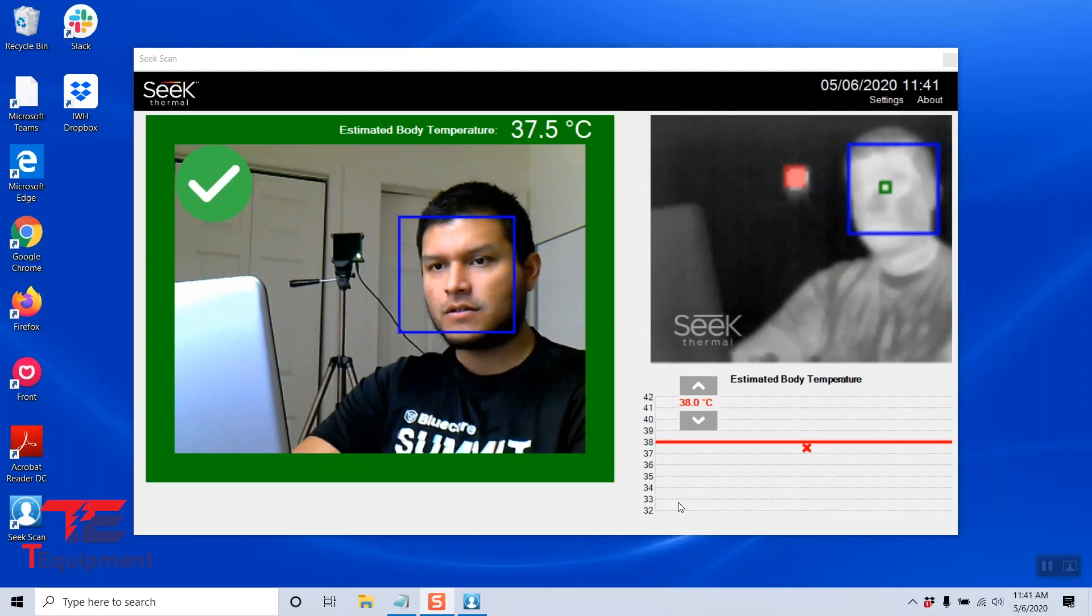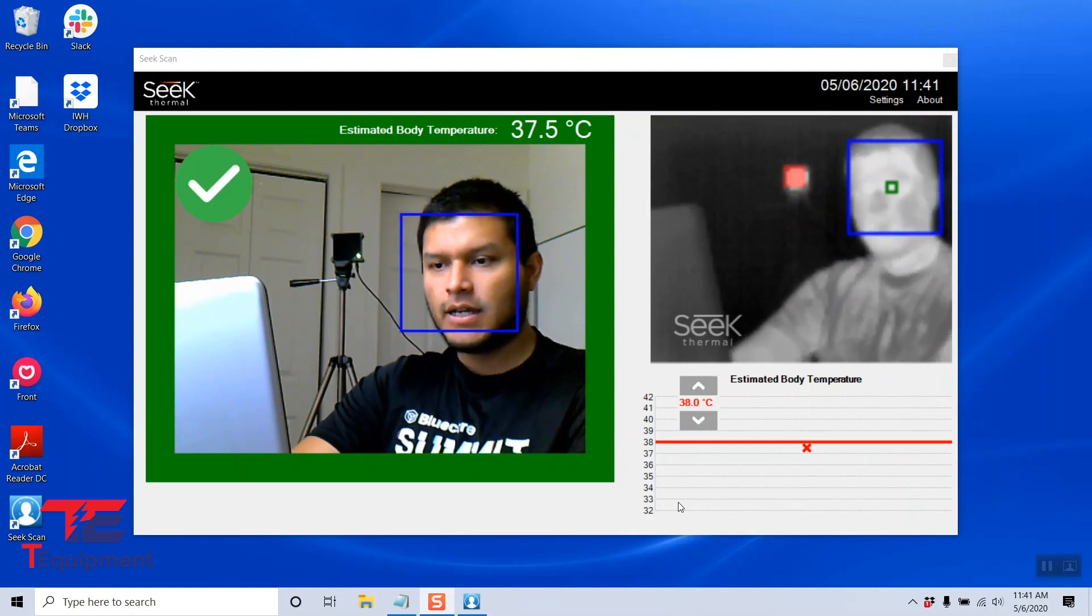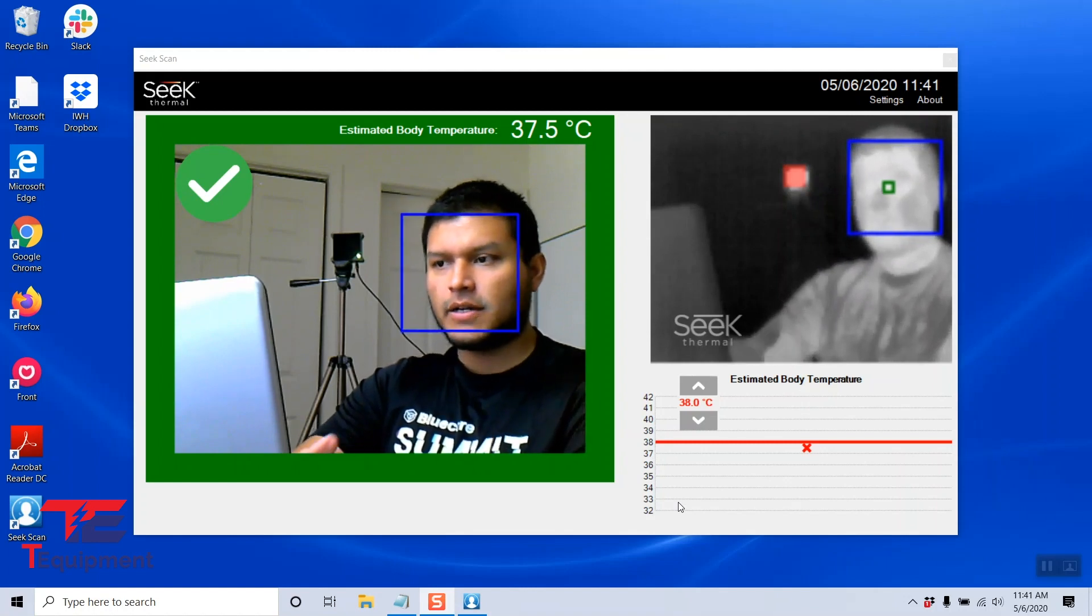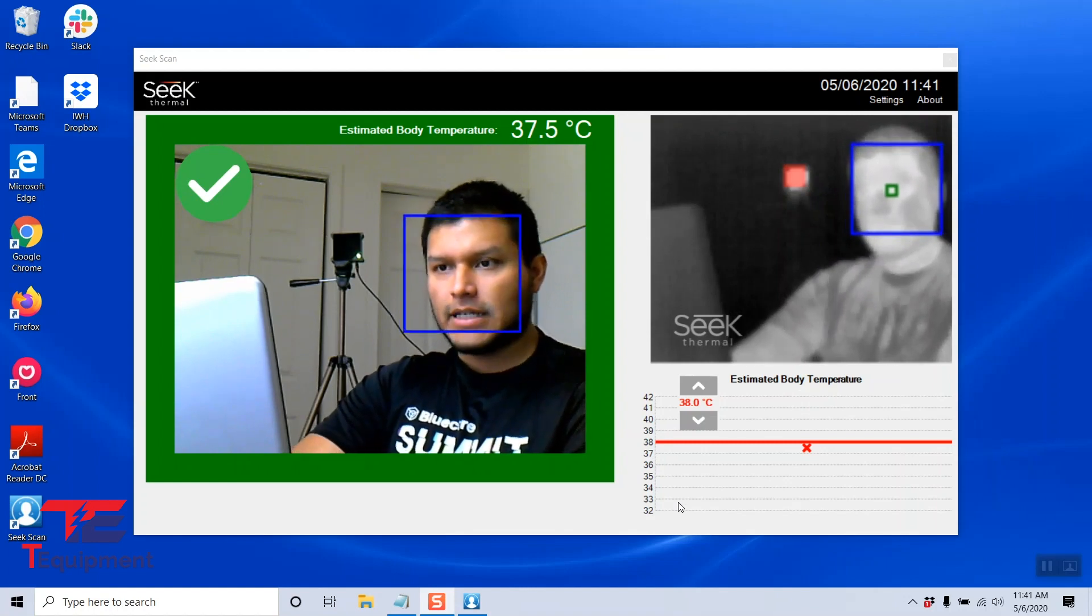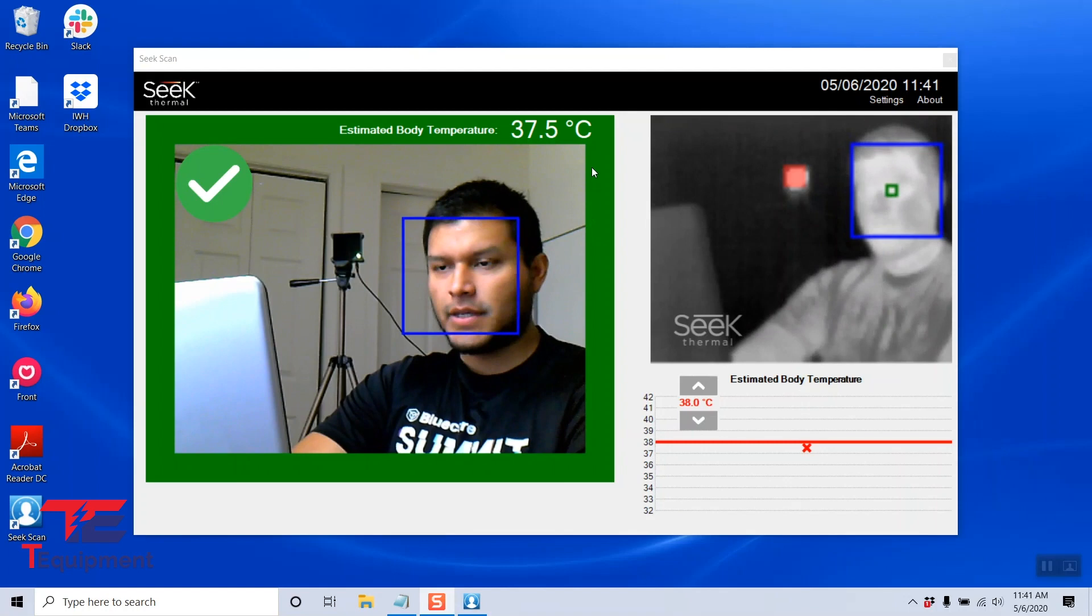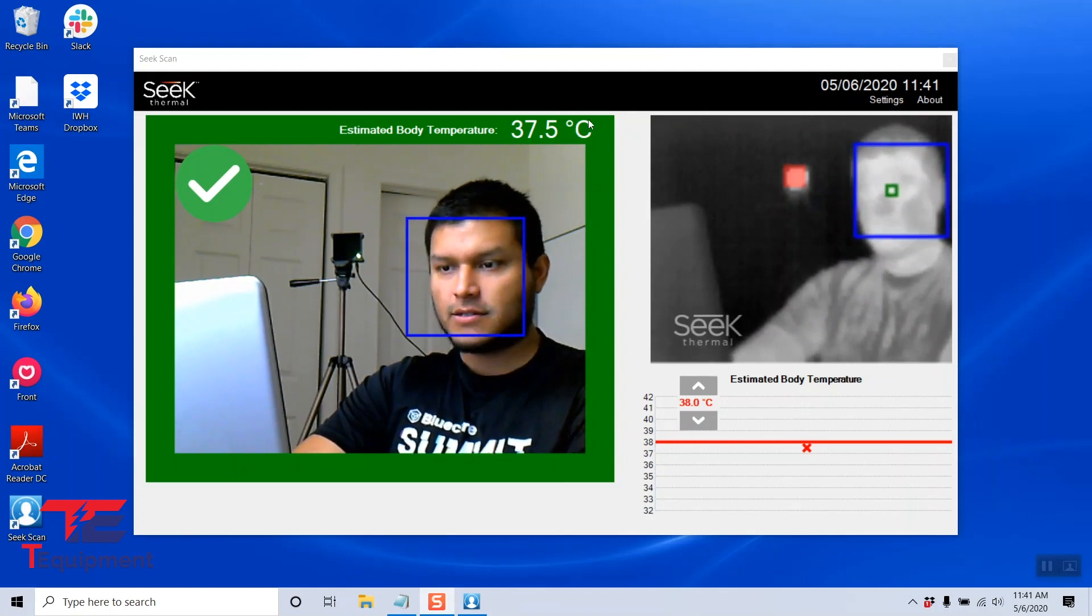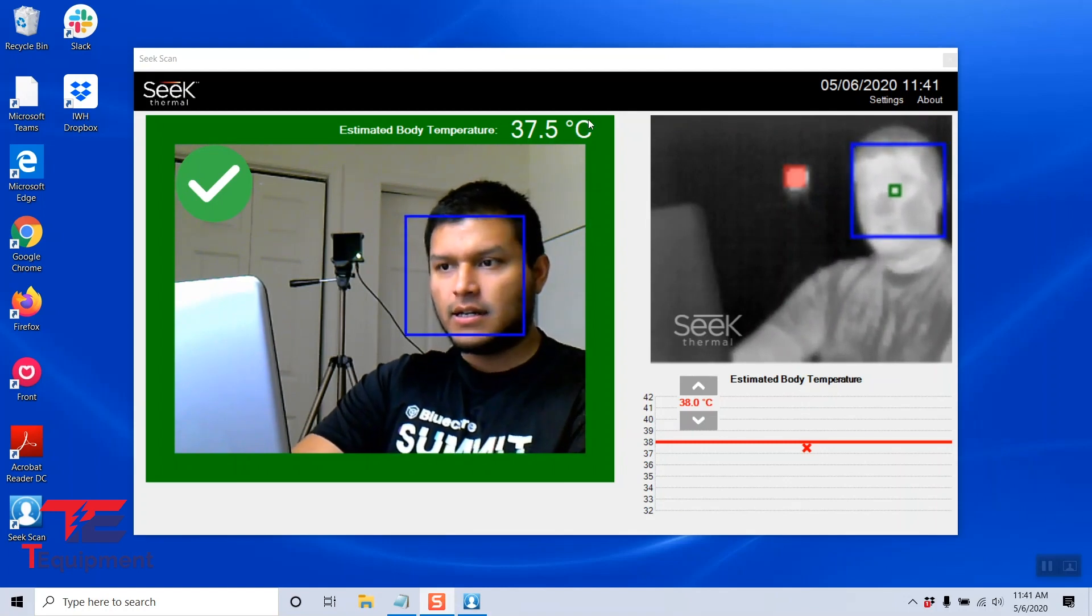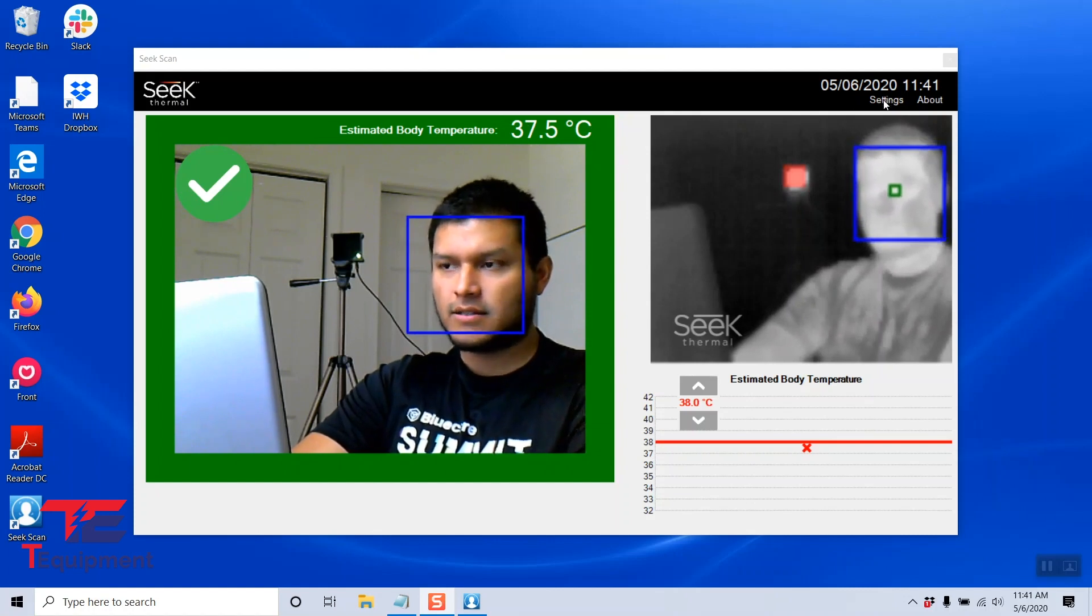Now that we have our Seek Scan software installed, we're going to talk about how to customize it. In this case, for me out of the box, it gave me 37.5 degrees Celsius. I'd like to convert this to Fahrenheit, so we're going to go ahead and go to settings on the top right.